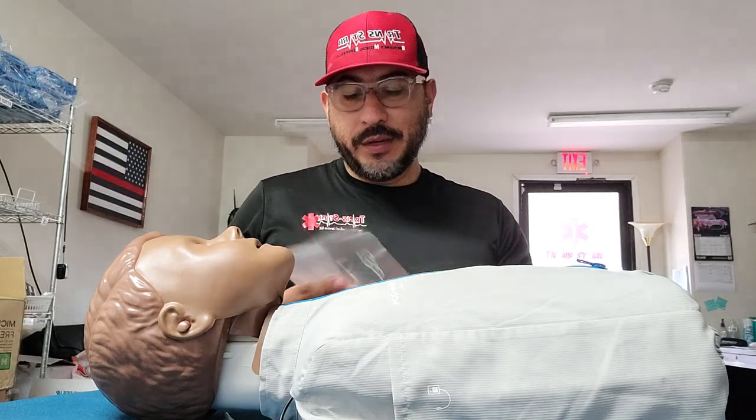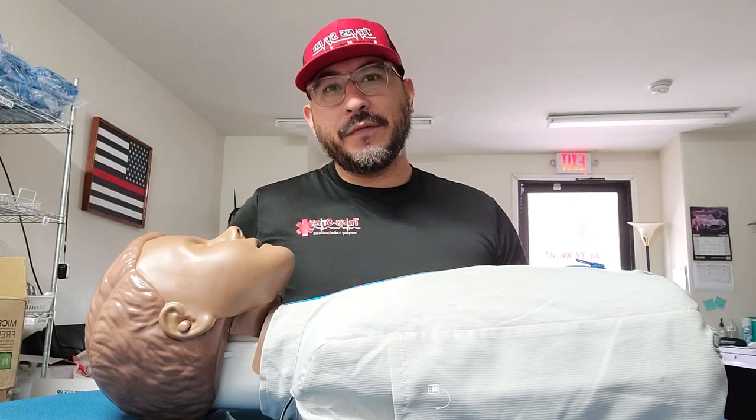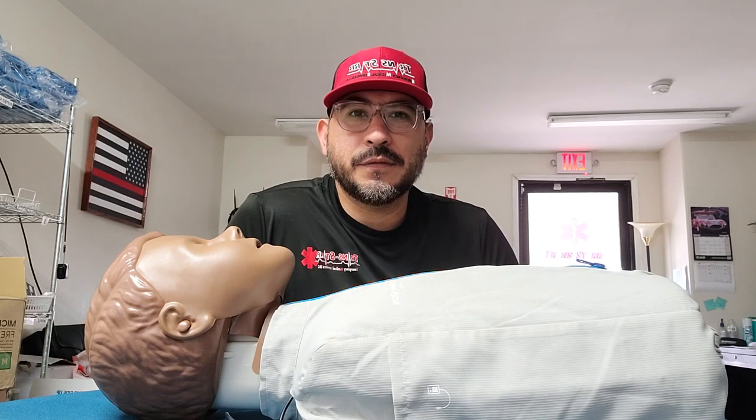For the rest of the rescue breathing — if the patient still has a heart rate — you just want to breathe for them one breath every five to six seconds if it's an adult. If it's a child or pediatric, it's going to be one breath every three to five seconds. I always tell the people that come to my class: there's a common denominator there, which is five. If you want to focus on one breath every five seconds, it works — it's within the guidelines of the American Heart Association, revised 2015.